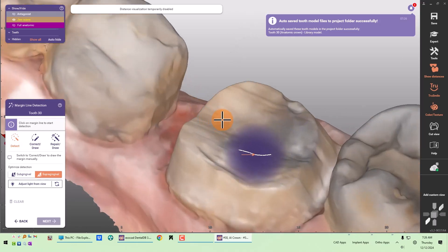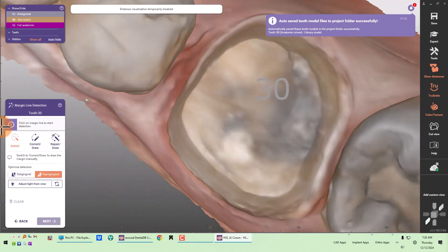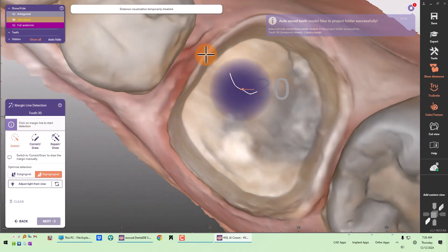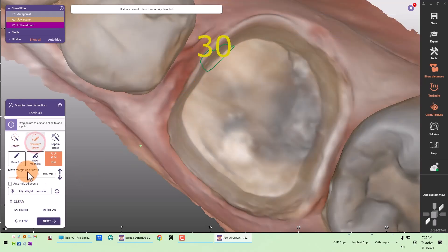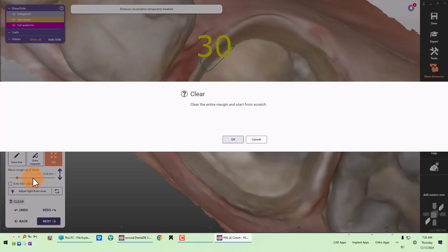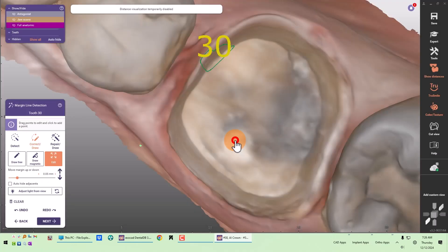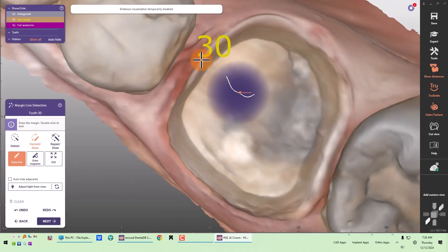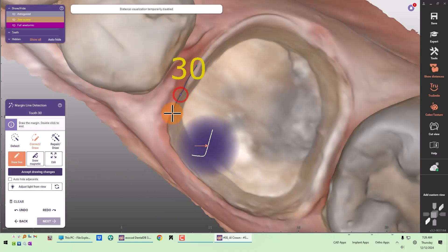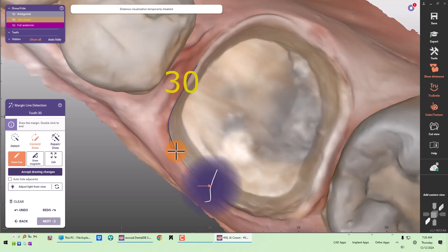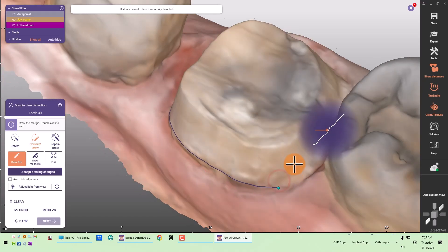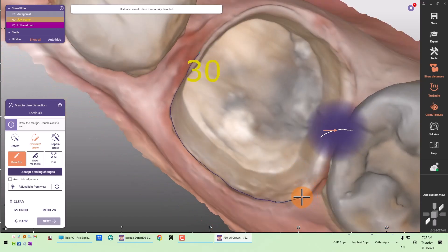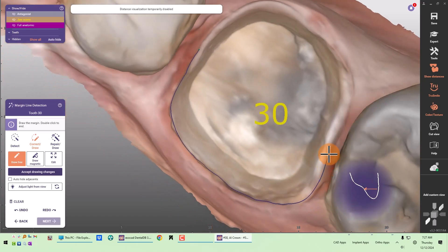Now it's just our normal crown workflow. I can detect the margin or I can draw free, which is what I normally do. But if you have a die — like at a lab where you scanned a die — your margin detection should just be a couple of clicks.